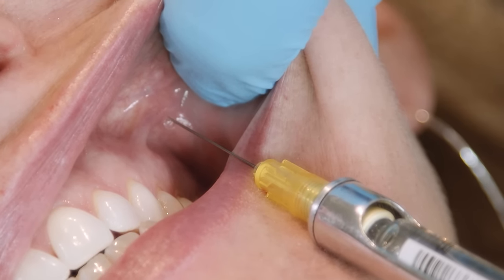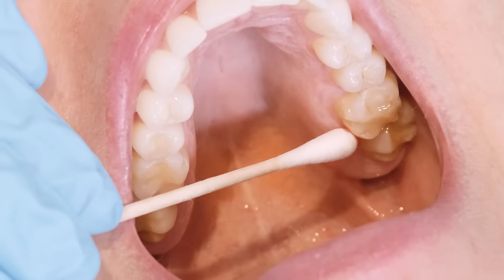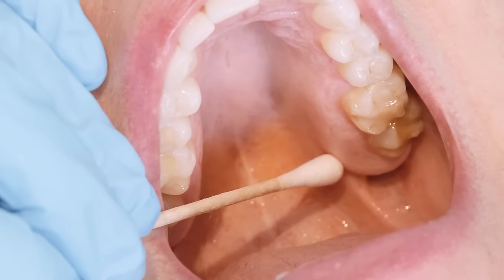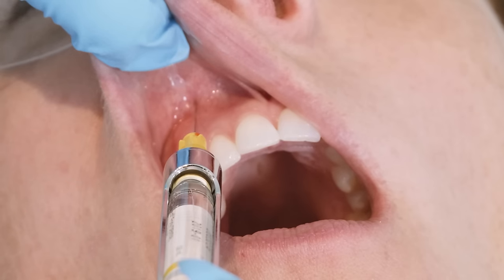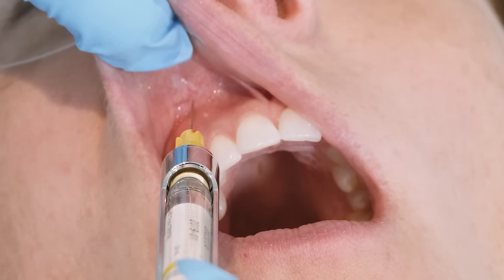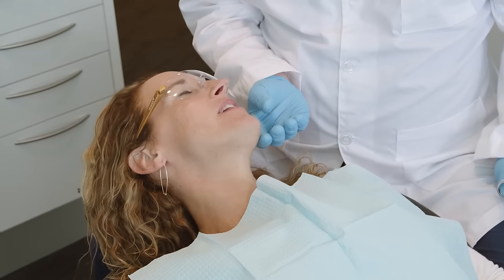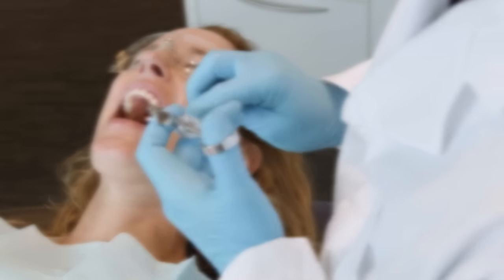Local anesthesia of the maxilla is commonly achieved by supraperiosteal injection. This technique works well because of the comparatively thin, porous nature of the alveolar bone, allowing the local anesthetic to reach the nerve fibers innervating the teeth and surrounding periodontium. Supraperiosteal injections can be used singularly to anesthetize individual teeth or in combination over an entire quadrant. On occasion, profound anesthesia may not be obtained, especially in the region of the maxillary first molar where dense bone may impede distribution of anesthetic.